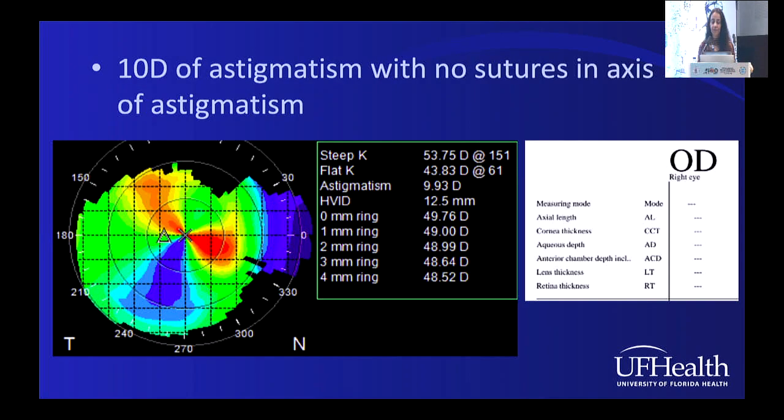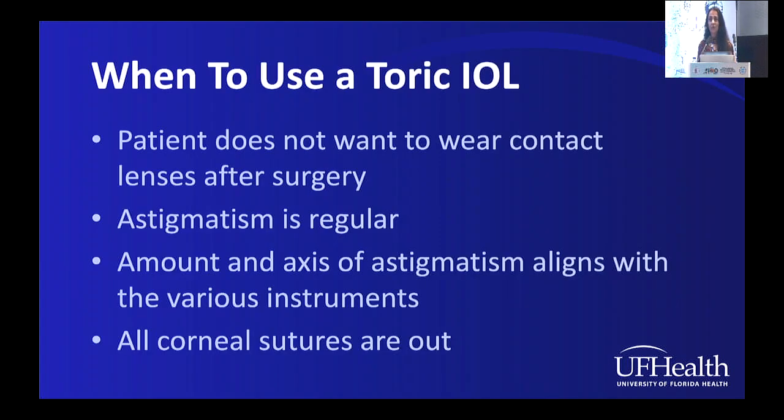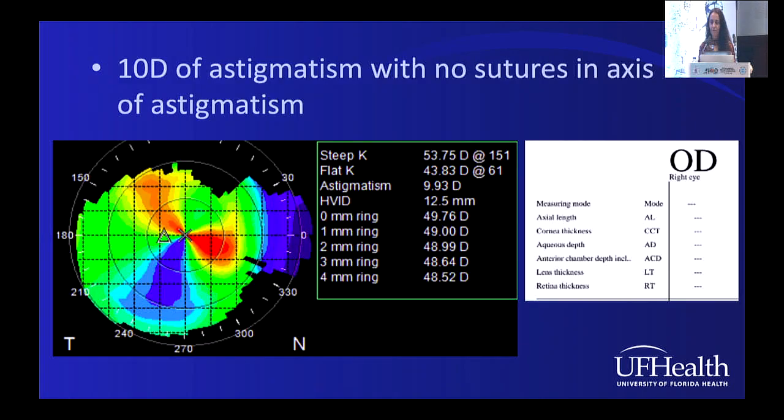And we used to tell people you can't get a toric lens if you are young, because you might need another transplant. Now we don't typically do PKs for PK failures. We do endothelial keratoplasty, which is more forgiving.